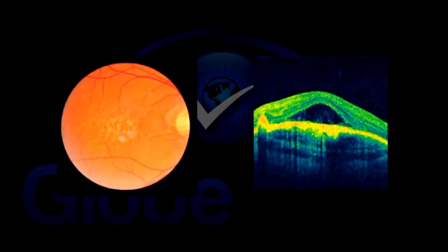Obvious macular drusen. Obviously, we'd look at that and say this patient is at risk for macular degeneration. They're going to need a referral, but is that an immediate referral? What's their vision? We don't really know. Are they seeing 20/30? Are they seeing 20/200? We do an OCT and we see that the patient has wet macular degeneration and they need an acute referral and treatment immediately or they're going to have vision loss that's going to be permanent.